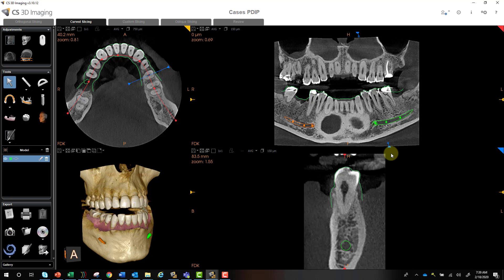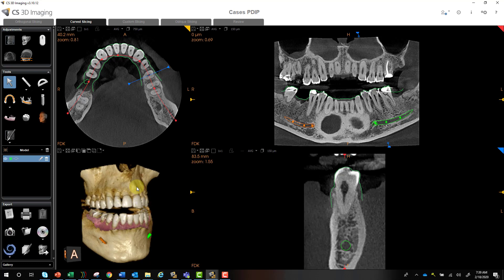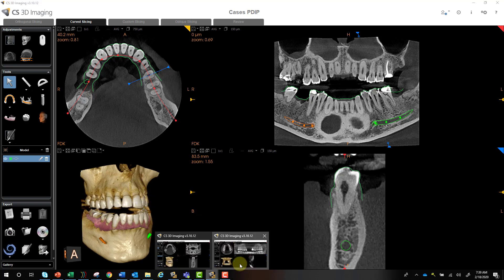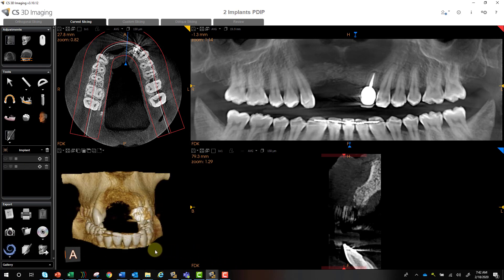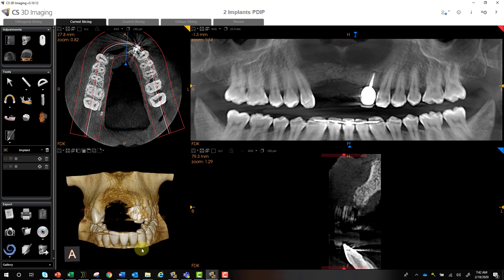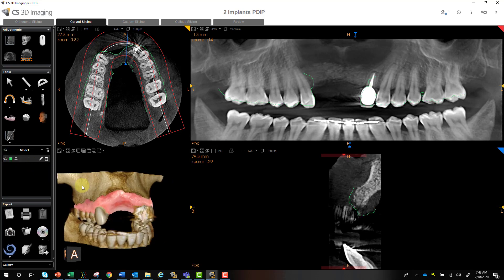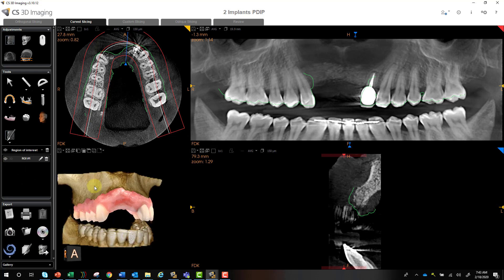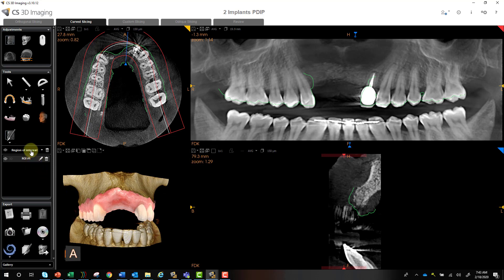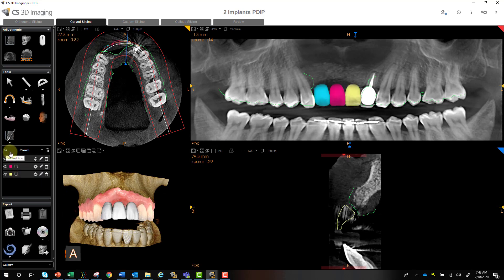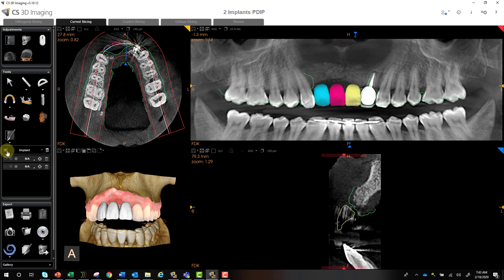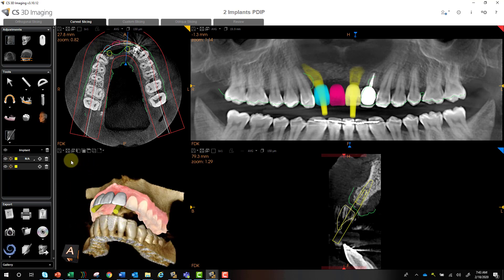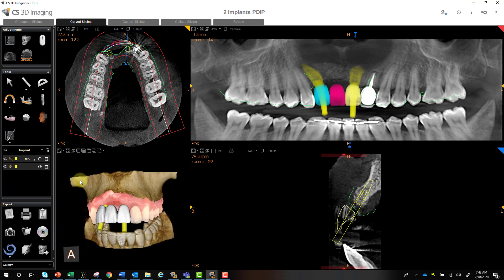Now obviously you don't have to merge a digital impression scan with every single case, but it can definitely be helpful in a variety of different cases. For example, we've got this large edentulous span in the maxillary anterior, and obviously placing implants here would be more challenging. But if we merge our digital impression scan and crop out some of the CBCT to visualize this better, then add our crowns, we have a much better visualization of where to place them, angles, and so on.